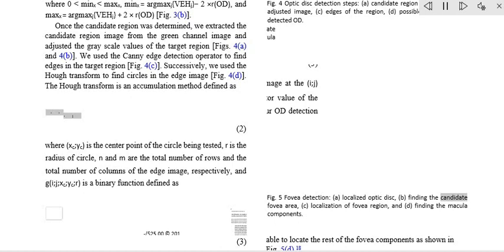Edge histogram descriptor. Edge information in an image can describe both shape and texture. We use the edge histogram descriptor, which is an element of the MPEG-7 standard, to extract the primitive information of the edge distribution [23, 24]. First, the retinal image was divided into 16 (4x4) subimages. A histogram of 5 standardized edge directions, shown in Figure 7, was computed for each subimage.